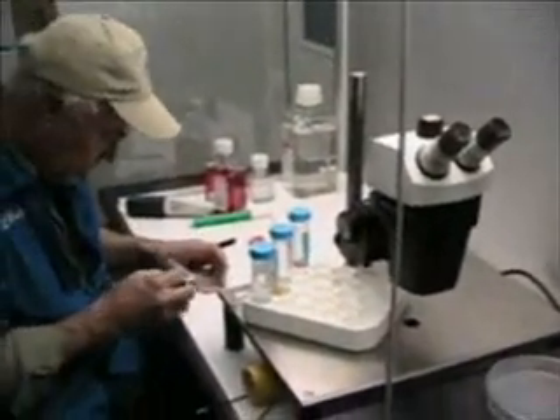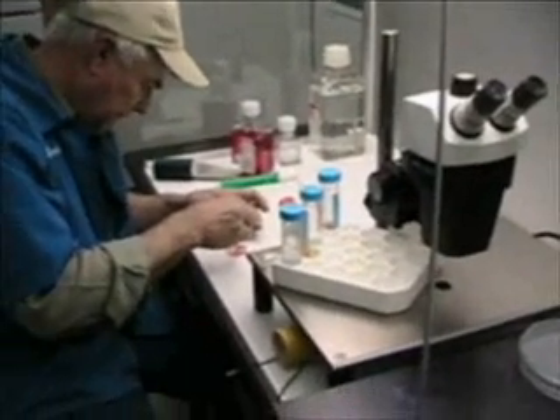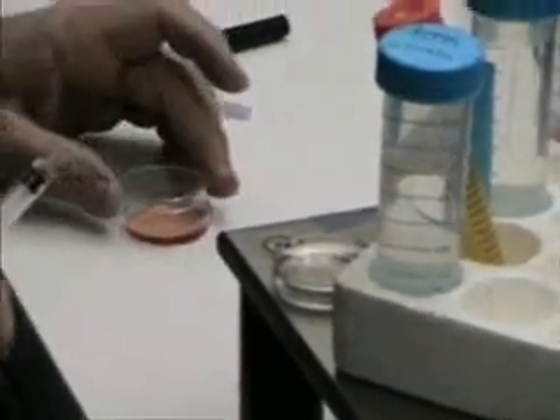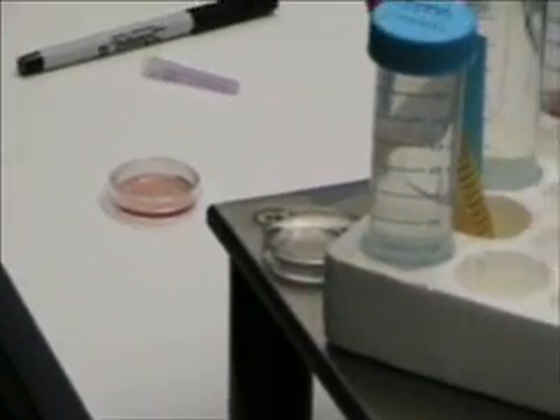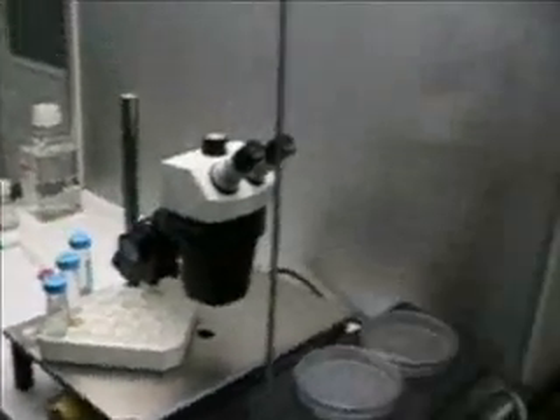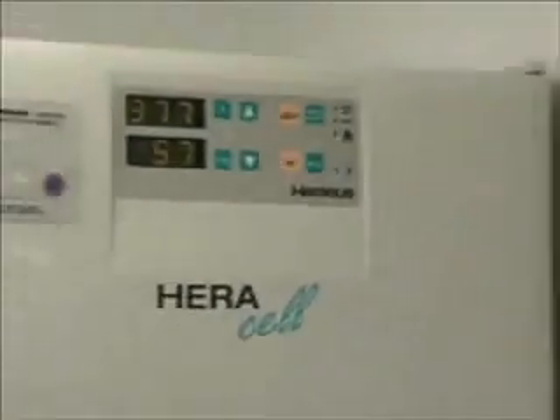We have an airflow hood and sterile media, which was derived from tissue culture media from human research. The oocyte, which was flushed from the mare's follicle, is then placed in a solution of tissue culture media in a small dish, which is then placed in the incubator and matured for varying lengths of time depending on the maturity of the egg when it was aspirated from the follicle. This is a CO2 incubator, with an atmosphere of 5% CO2 maintained at a temperature of 38 degrees centigrade.